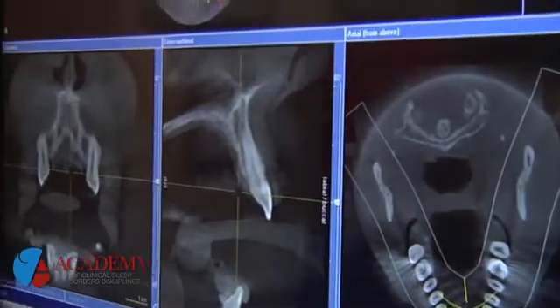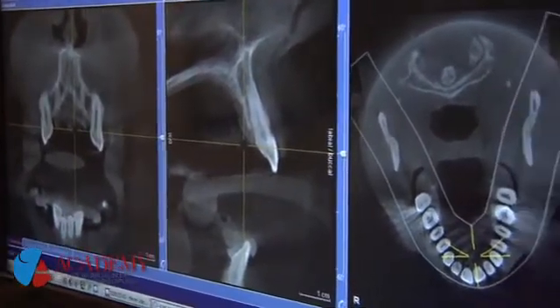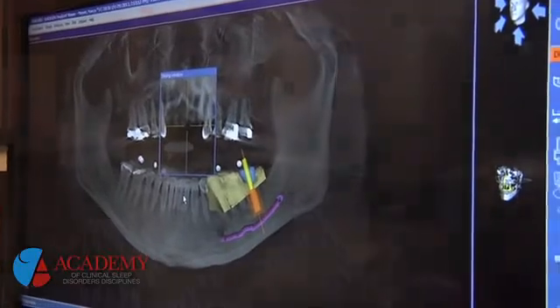With respect to the imaging, it's absolutely crucial that you understand now what you're looking at, because you can see more structures. You have to see and know where they are three-dimensionally in ways that we really hadn't looked at before. We didn't need to. We didn't have the technology to do that. We understood from the anatomy that those structures were there, but now we had access to them, so we had to certainly dust off that knowledge base from dental school for me 35 years ago.